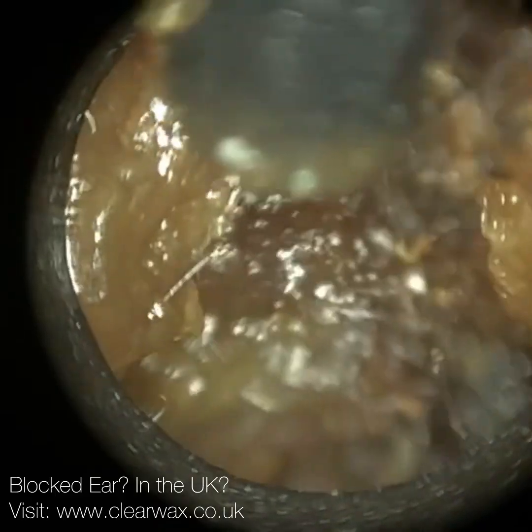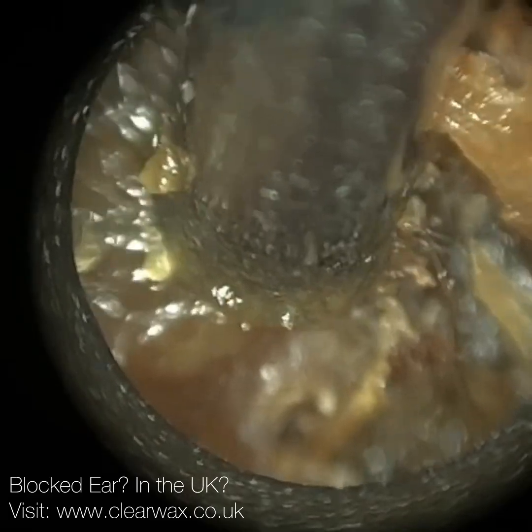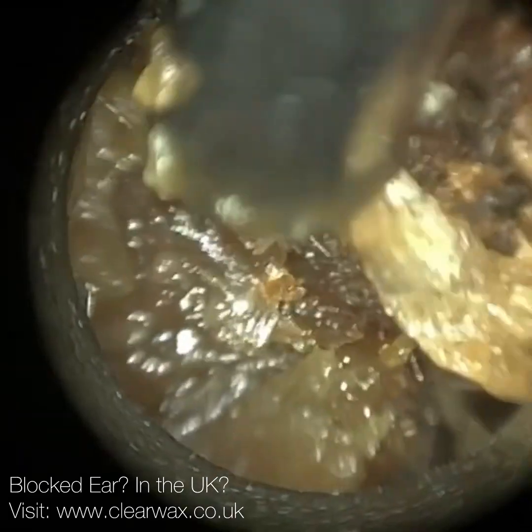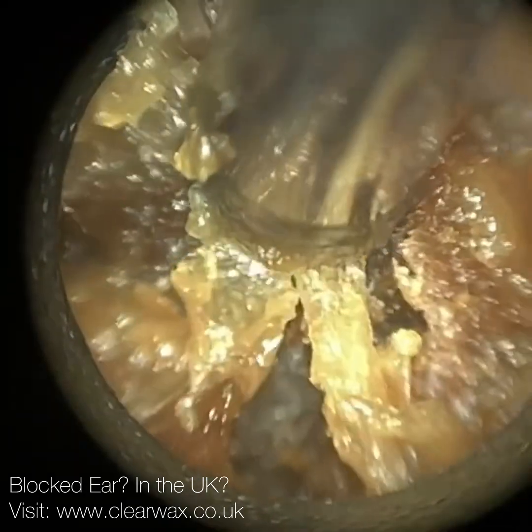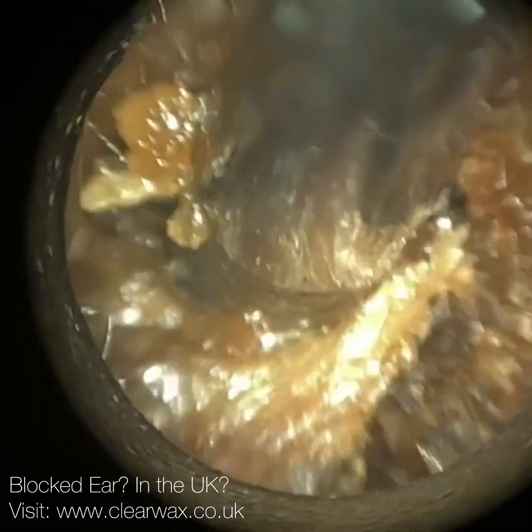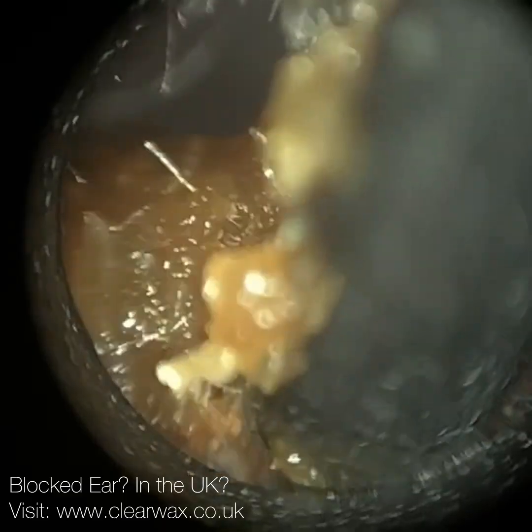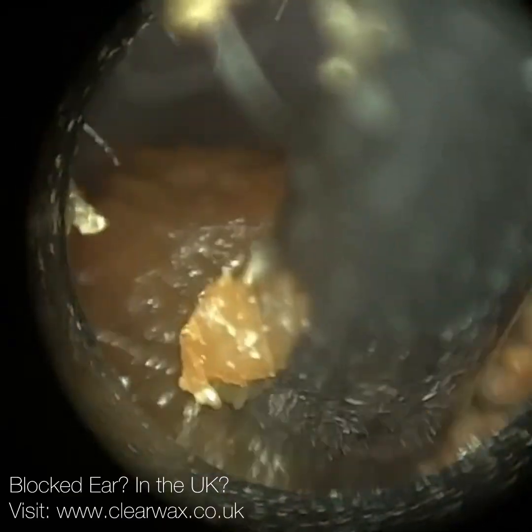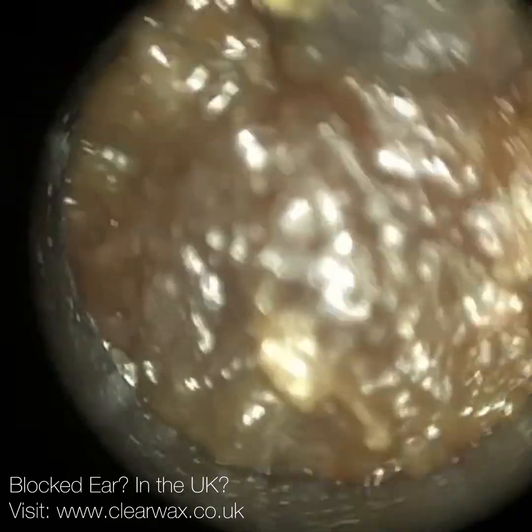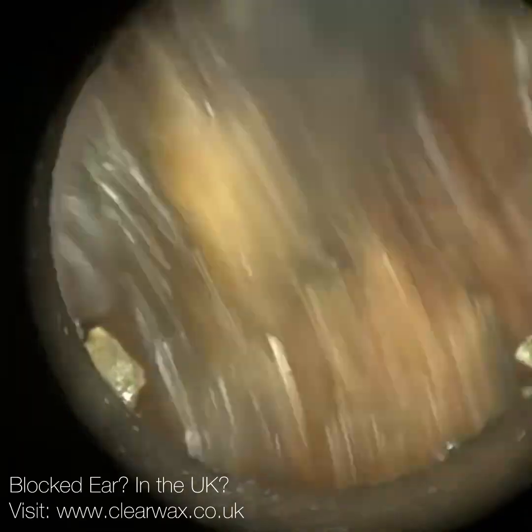Sometimes when we examine people's ears, these grommets are loose or they're impacted with wax, so we remove them ourselves. The T-tube grommets are typically referred to as long-term grommets, so they're there in some cases for the rest of someone's life. This patient had standard grommets fitted previously, but they kept falling out within a couple of weeks, so the ENT surgeon decided to fit the T-tube, and it's been there for a couple of years now. The reason why this patient had grommets or a ventilation tube fitted is because they've got chronic blockage of their eustachian tube.